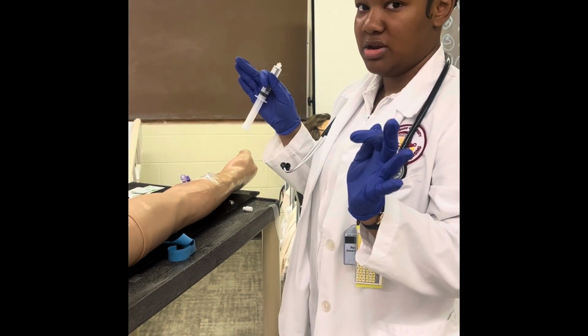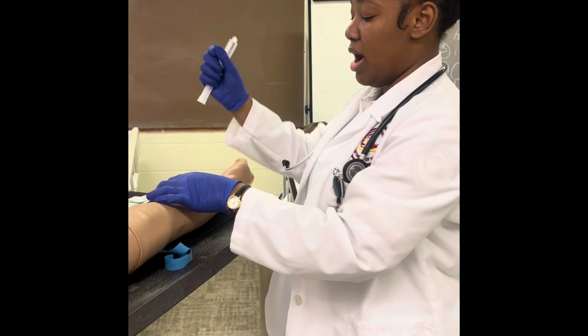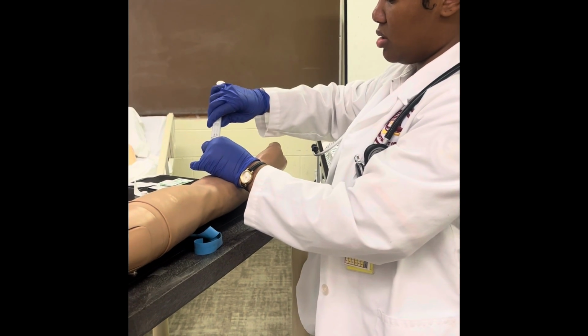And then I don't have any extra saline on me. But before I administer my medication, this is gonna be my medication today, I would flush with some normal saline to make sure it's still patent. Now I'm gonna hook up my medication.